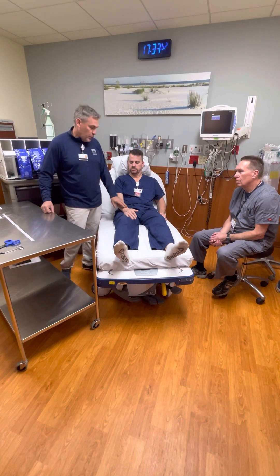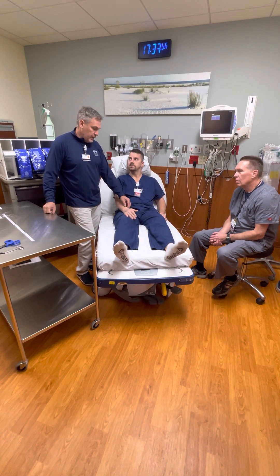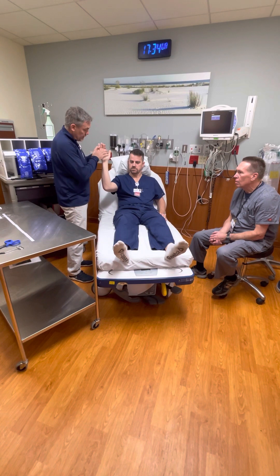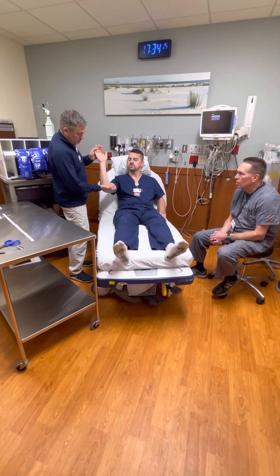He's got a non-displaced fracture of the distal radius. It's not angulated and not completely displaced where it could shorten - this one just has a crack through it. So we're going to put a volar splint. The volar or palmar aspect runs from here to here, and the hard part of this splint is going to run from about this position to this position.